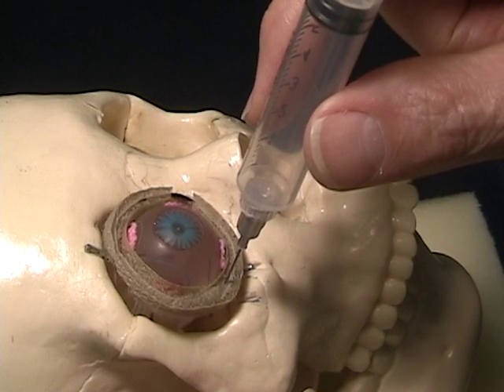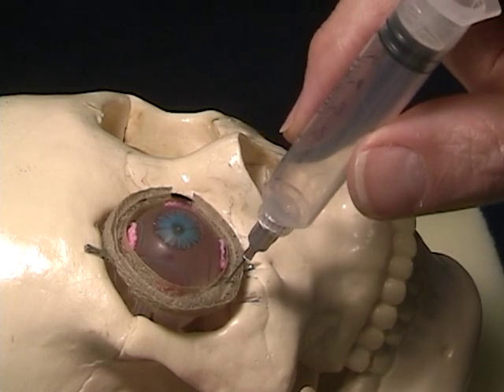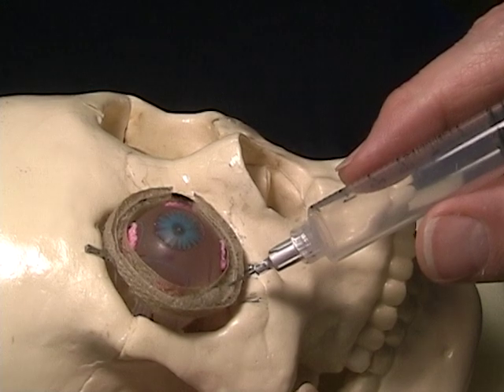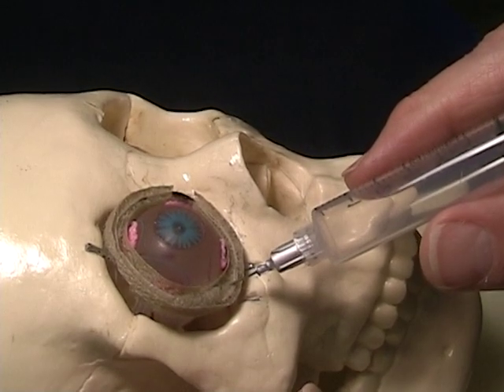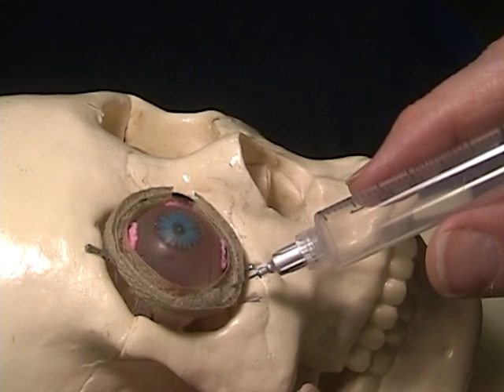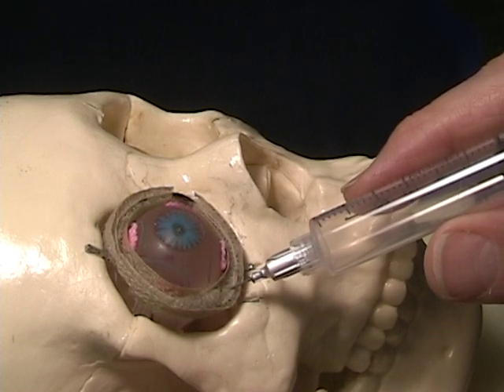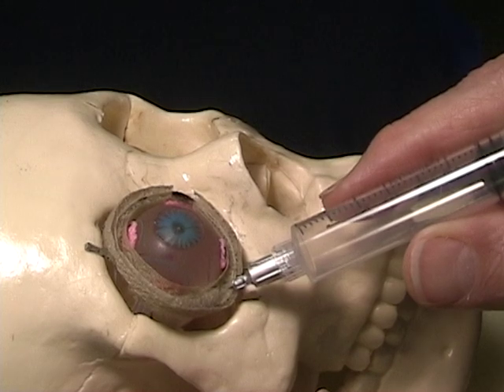Once the needle has been inserted to that depth, we will then begin to drop the syringe towards the infraorbital rim. As it rests down on the infraorbital rim, we'll reassess our landmarks, making sure we're lateral to the lateral limbic line, approximately parallel to the nose. Then we will begin to insert the rest of the needle to a full depth of 1 inch or 25 millimeters.